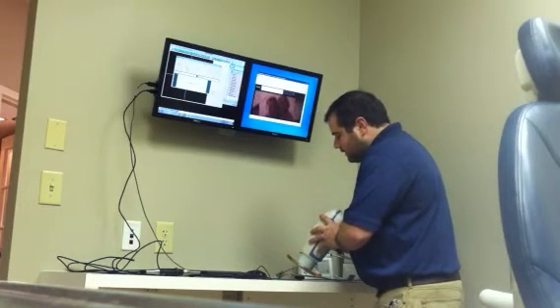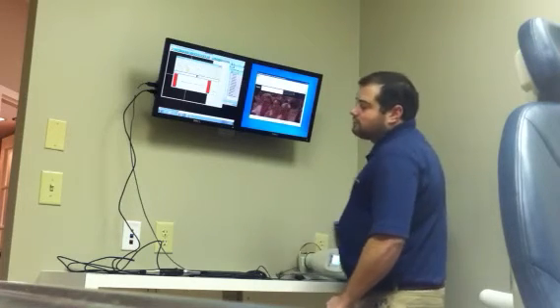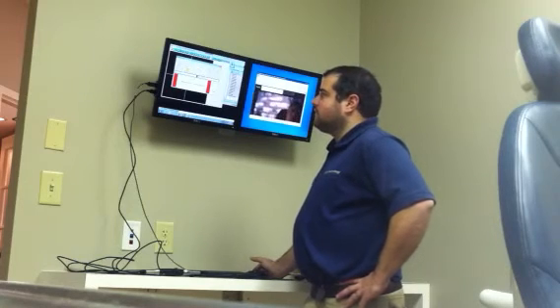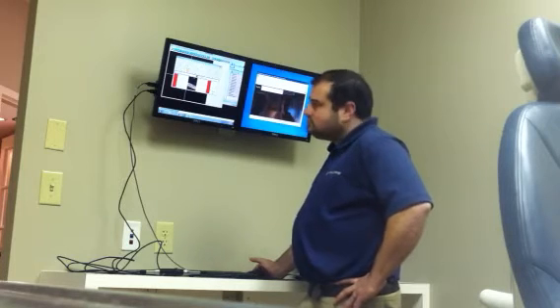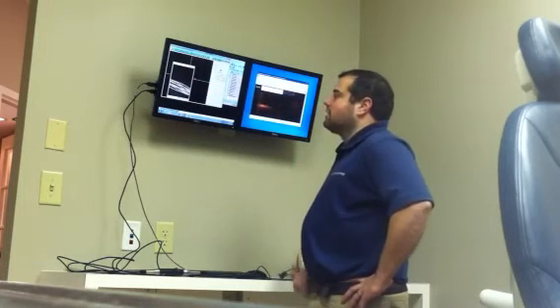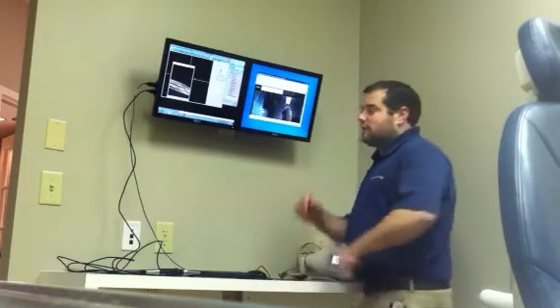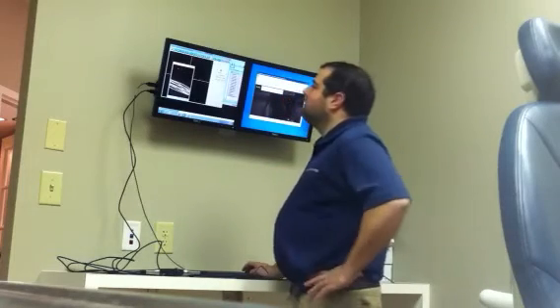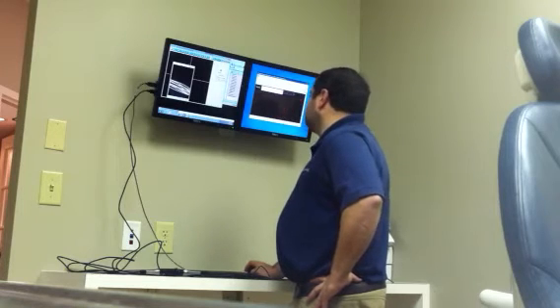and trigger our X-rays. I'm going to count about 2, 3, 4, 5, 6, 7, 8, 9, 10, 11. Right around the 11-second mark before we have image return. Of course, it's because we are moving X-ray data off to the cloud and then pulling it back down for display. So, not too bad, all things considered.